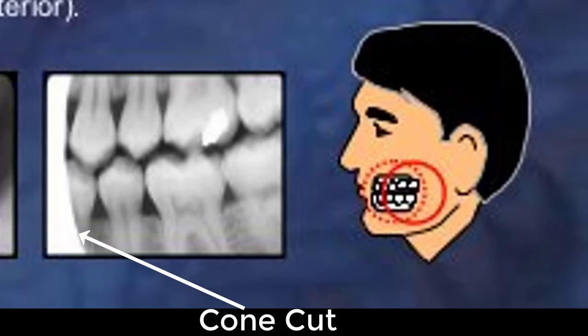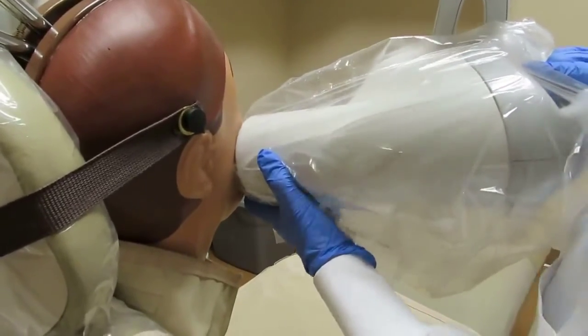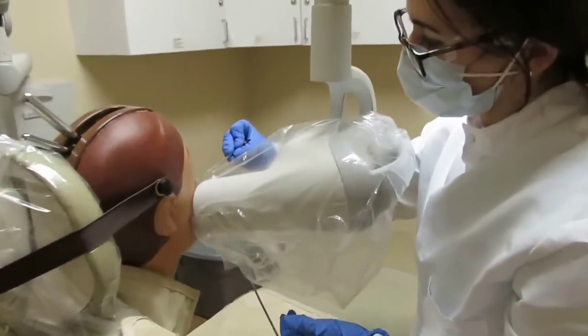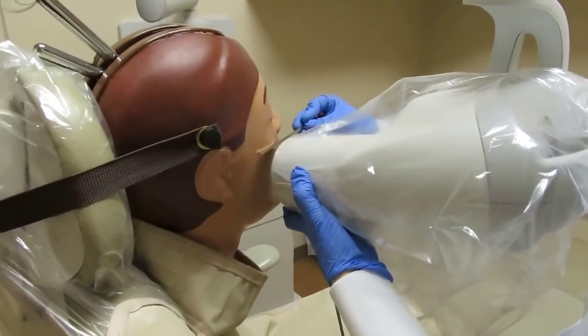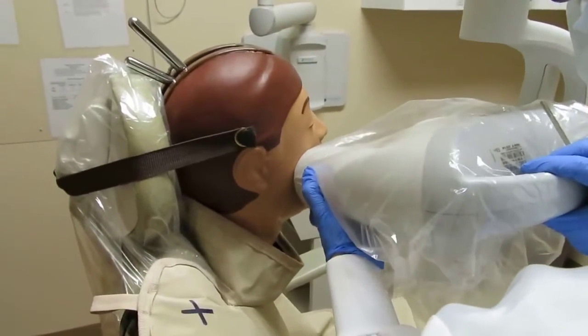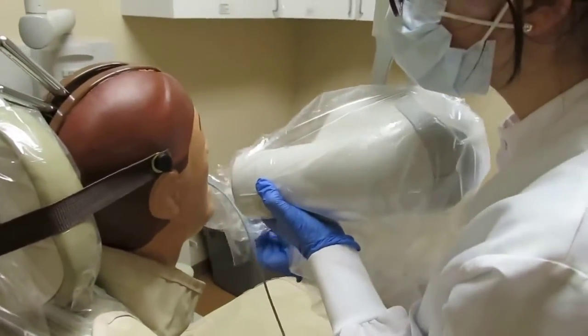In order to avoid cone cuts, which are unexposed areas of the receptor, we must stand directly behind the tube head and make sure that the receptor is completely covered by the tube head. For the purpose of exposing on dexter, examine the curvature of the zygomatic arch, and line the tube head with the eyebrows slightly under the zygomatic arch. Rotate the tube head, making sure it is parallel to the curvature of the zygomatic arch, and that the central beam of the tube head is visualized going straight through the contact areas of the teeth.